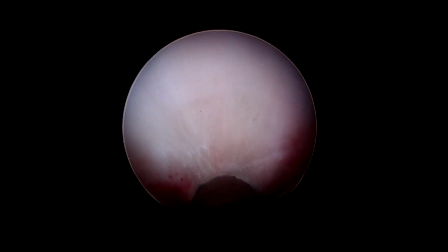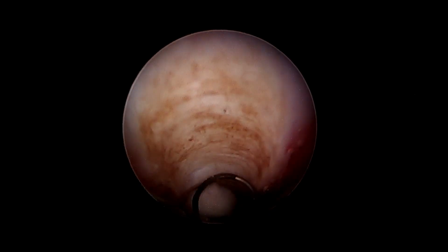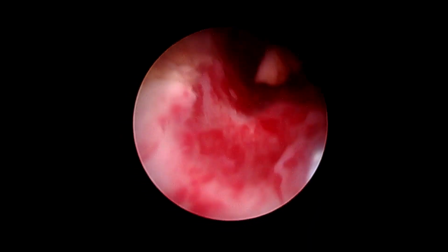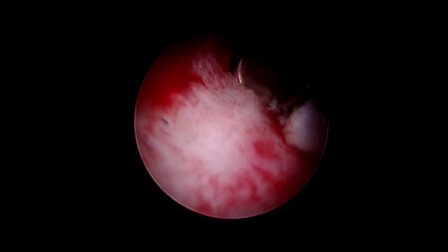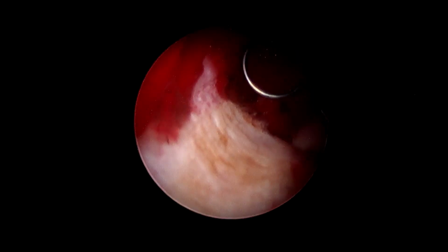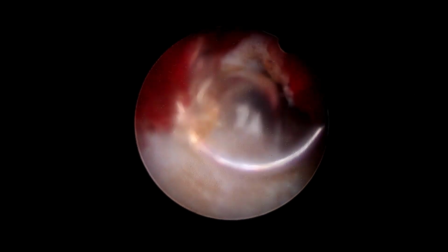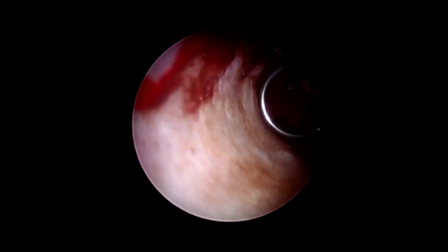You can notice this white colored scar tissue on the wall of the uterus, and right next to it we have normal endometrium on the right side. This is the posterior wall of the uterus where we had cut the scar, and I'm excising even that. You can notice how thin films I'm taking off the scar so that I don't injure the underlying muscles.